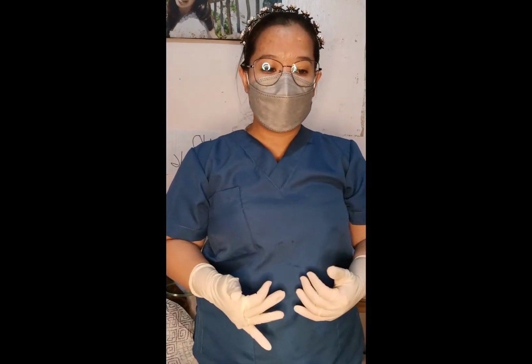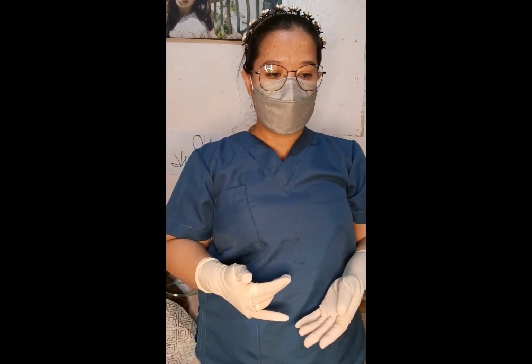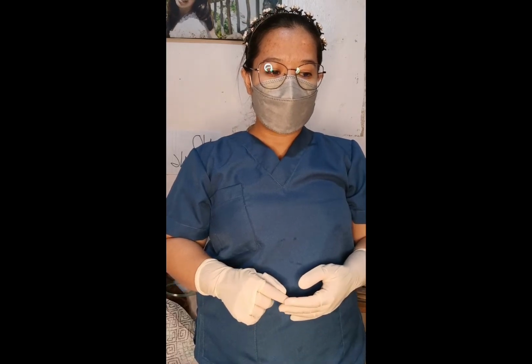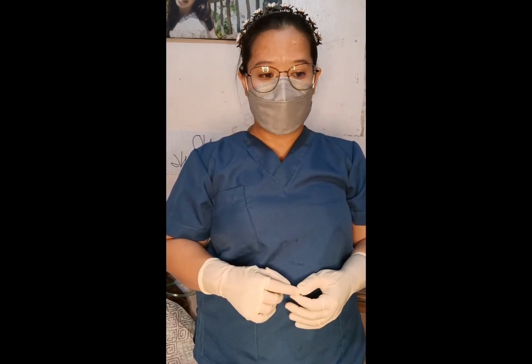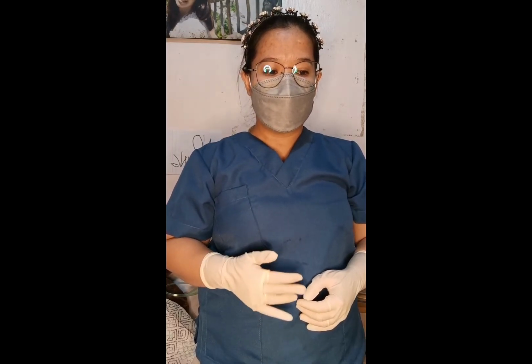Lastly, we need to monitor continuously by assessing for pressure areas on the skin and nerves every 2 hours and rechecking the flow rate every 4 to 8 hours. This permits early detection of skin breakdown and adequate flow rate.